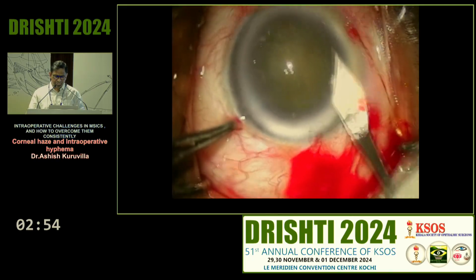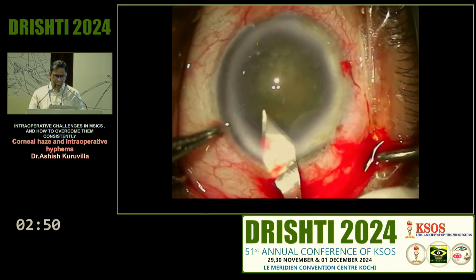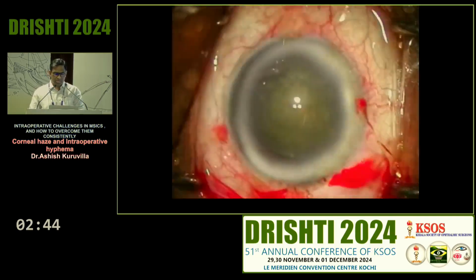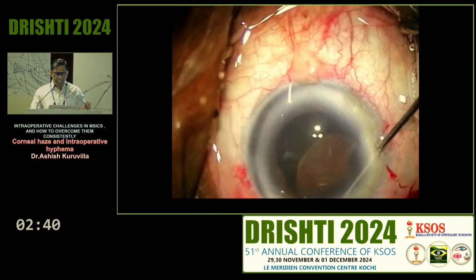So this particular patient, internal lip, I'm just showing you here that it is a very nice healthy 2 millimeter internal lip. There's no problem with the incision at all. And normally speaking, I would just put one suture there at the main 2.8, that central area. But this particular case, I struggled a lot.